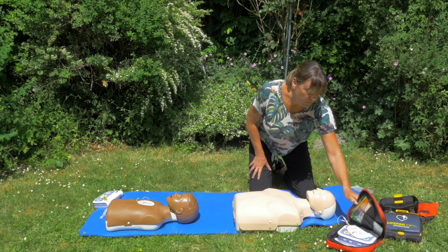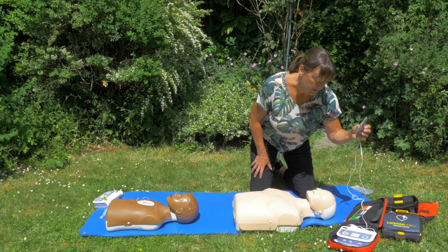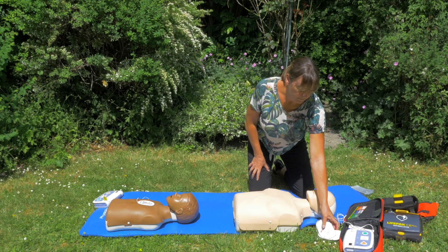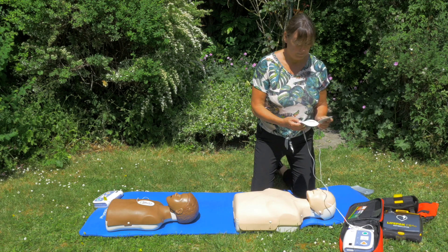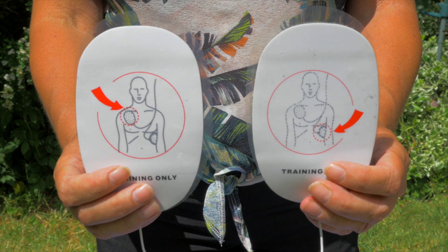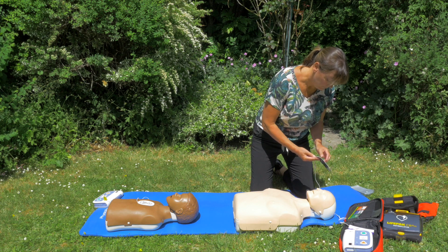This here is a trainer unit — these are the ones you'll be using when you attend your face-to-face session. We can turn it on. It will say 'Apply pads to patient's bare chest' and 'Plug in pads connector next to flashing light,' then 'Apply pads' and 'Plug in connector.'